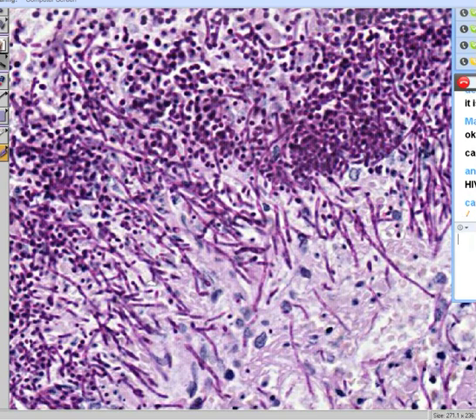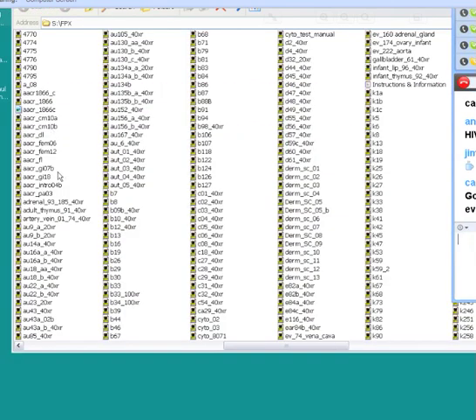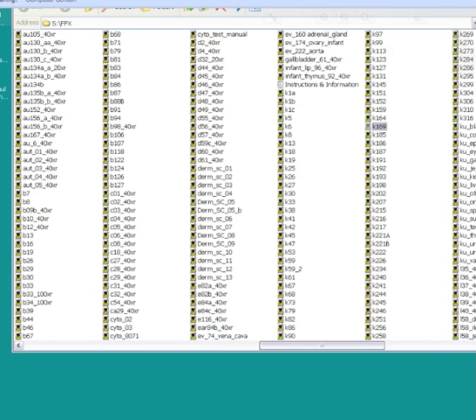Let's do one more case, and then we'll take a break, okay? You don't have a choice. I don't have to ask you, okay? You don't have a choice. Let's go to case number AACR 1831F. It better be there. It's not there. So let's go to the other one then. Let's go to 081.